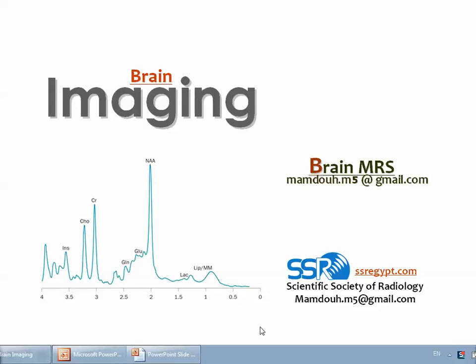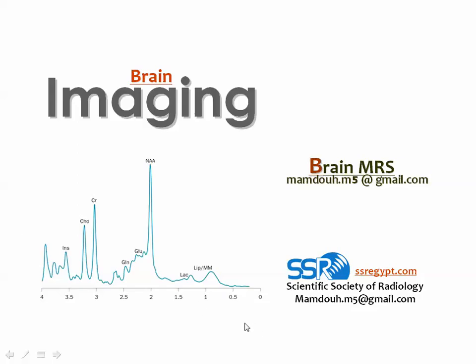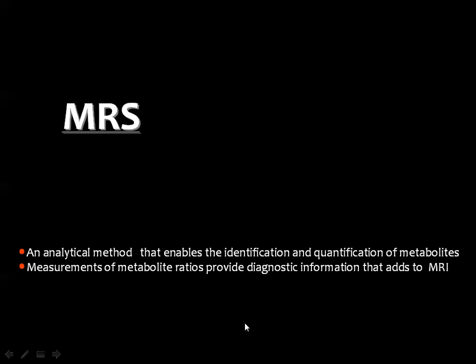Dear colleagues, now we will discuss this topic about the MR spectroscopy of the brain. As you all know, the spectroscopic analysis of the brain entails the use of MRI to produce some sort of a curve that indicates the presence of some metabolites in the sampled brain tissue, and according to the peaks of these metabolites we can sometimes know what is the underlying pathology.